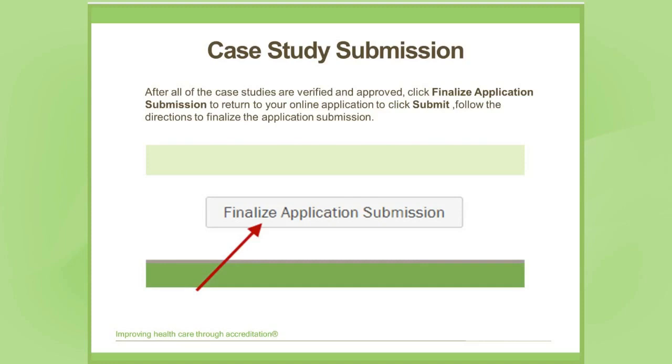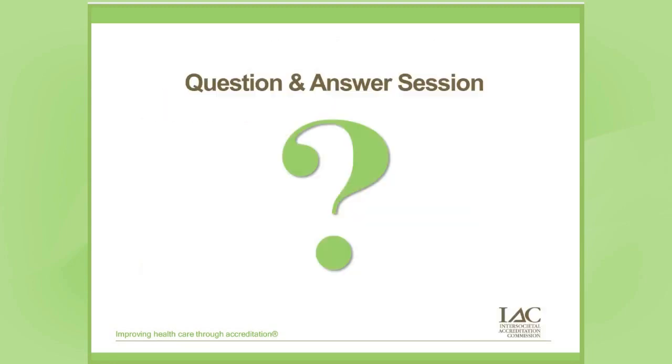I have a question for you, and this is actually mostly nuclear specific, but if you have hard copy images, how are those uploaded? So with hard copy images, if you have a scanner that is medical grade and does not decrease the quality of the images, you can scan them as a PDF and upload that.